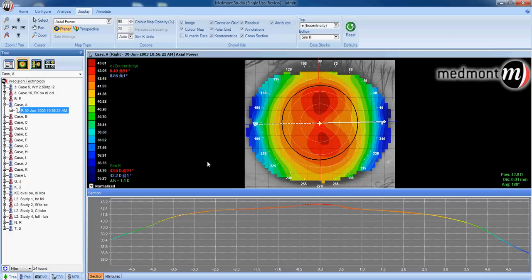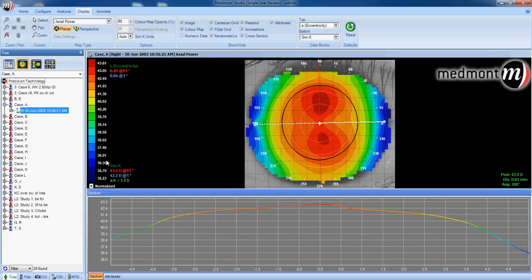Once we do that, you can analyze these topographies a number of different ways. The first way we might do so is to look at the SIMK readings. This is our keratometry readings as determined by your MedMod topographer.